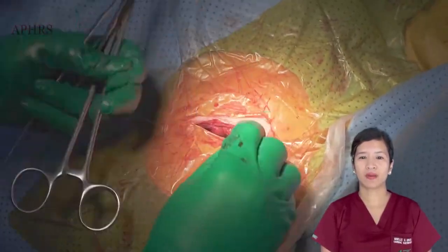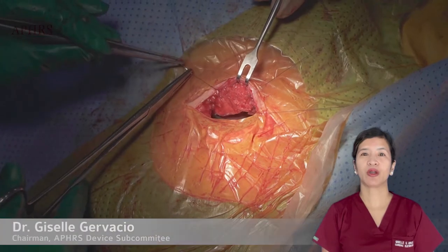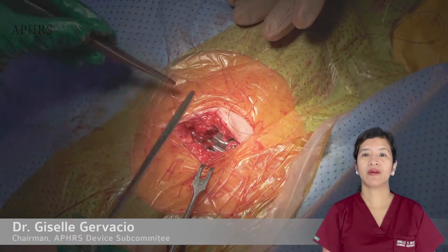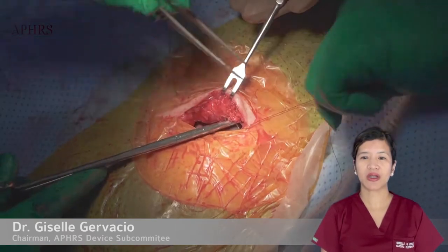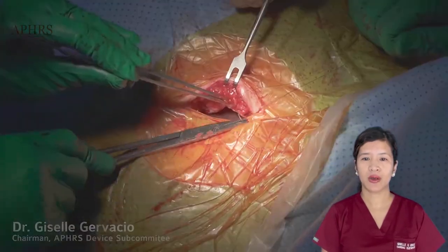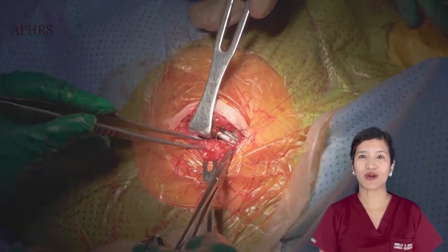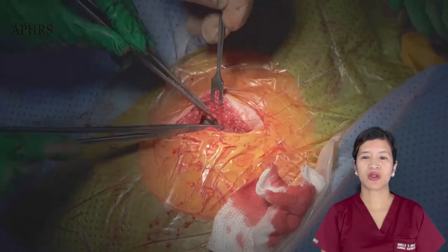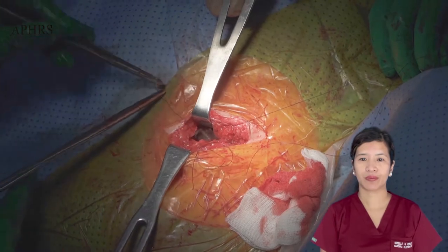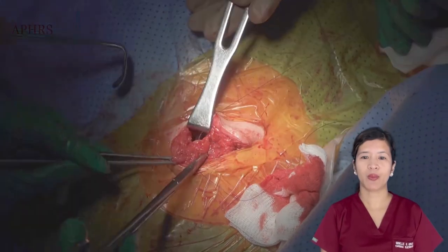Pocket closure is most important because it ensures that the device seals properly in the right plane and prevents migration of the device into other planes. I usually start with a monofilament 3-0, making a knot at the corner. The most important layer is the first layer, where we close and make sure to capture the pectoralis fascia, because this fascia is what defines the walls of the pocket.